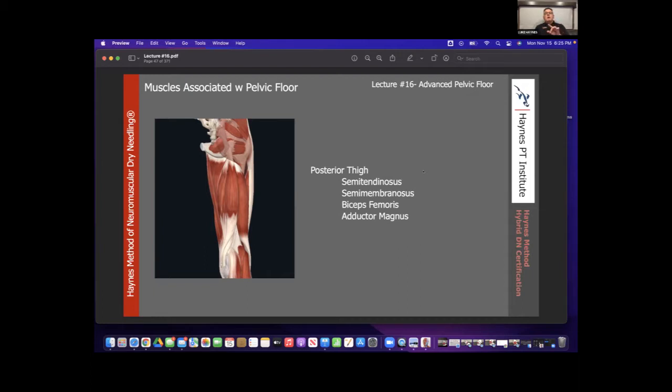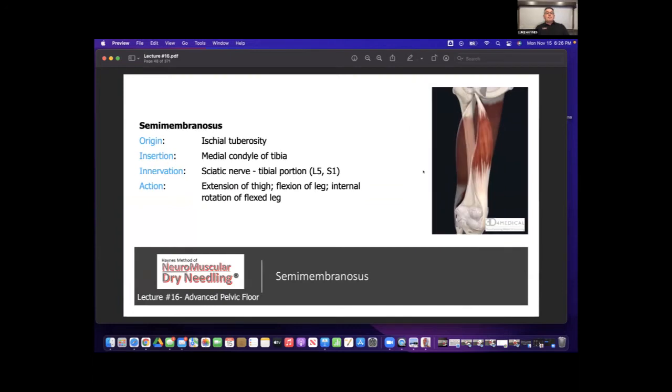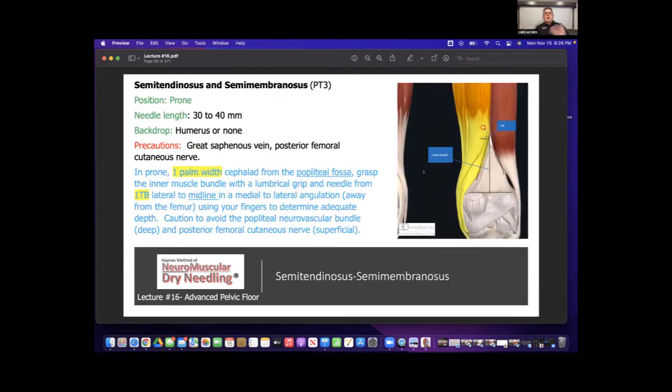Dealing with the hip, we talked about needling the muscle both distally and proximally, and also needling that common tendon for the hamstrings right there on the ischial tuberosity. Again, here we're demonstrating our distal needling approach.